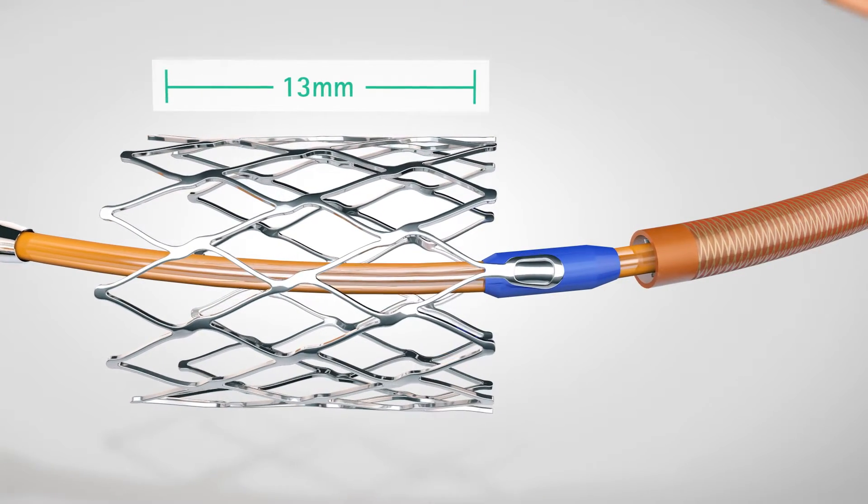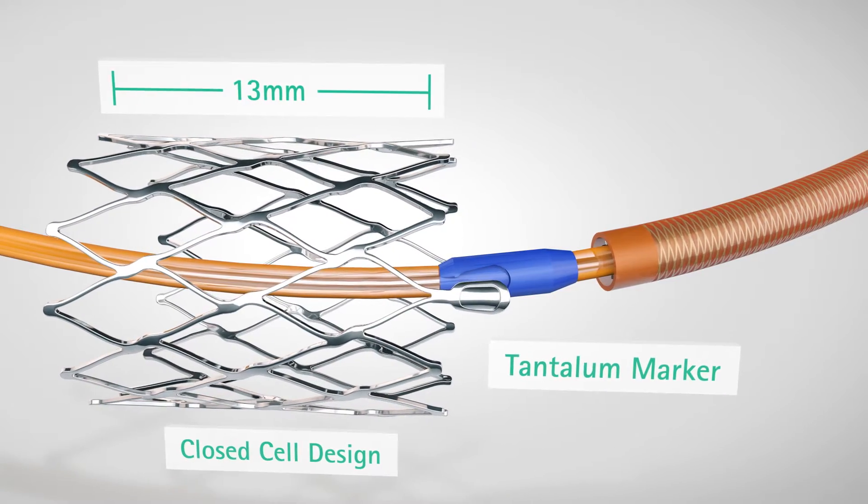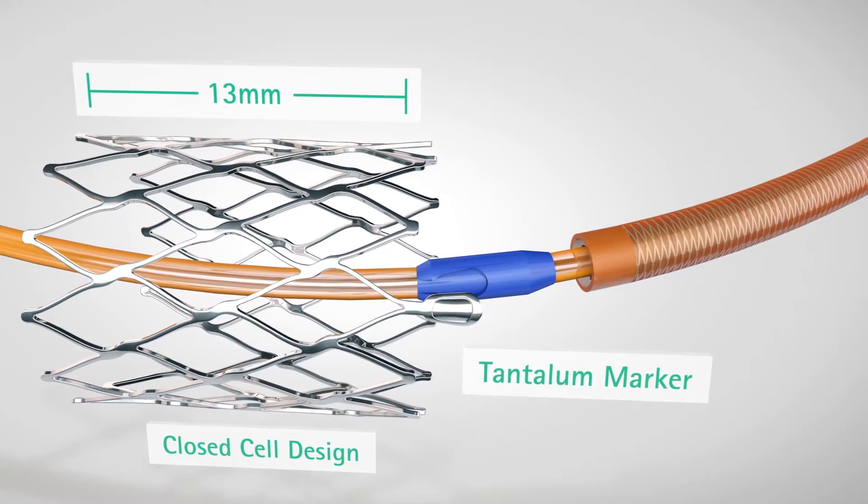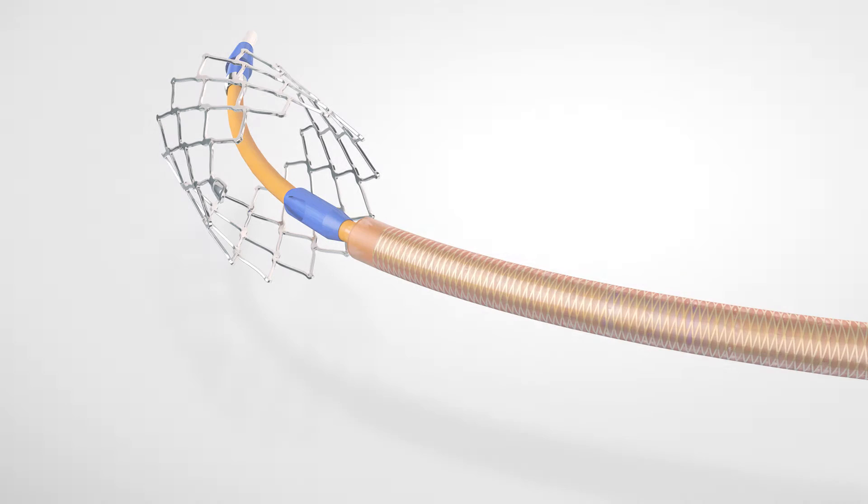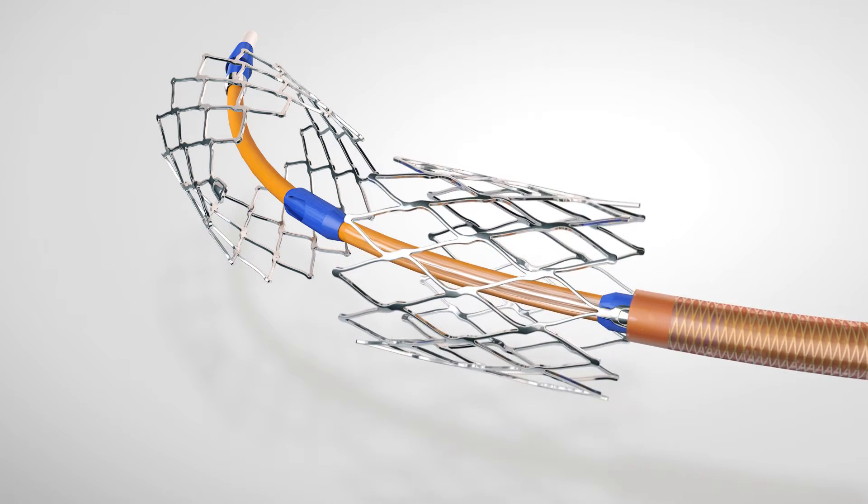The 13mm long stents have a closed cell design with tantalum markers on the proximal ends of the stents. The tantalum markers also help to prevent stent jumping.